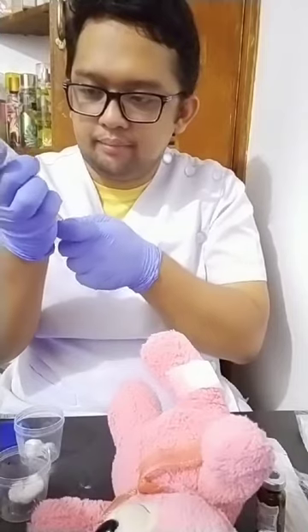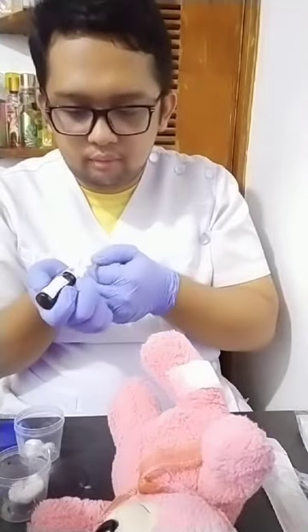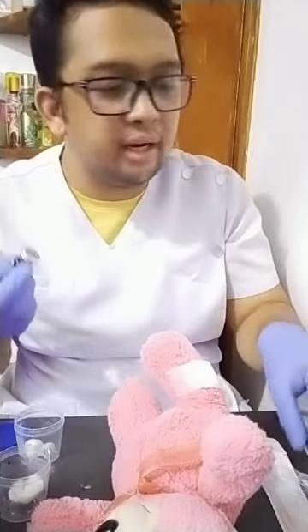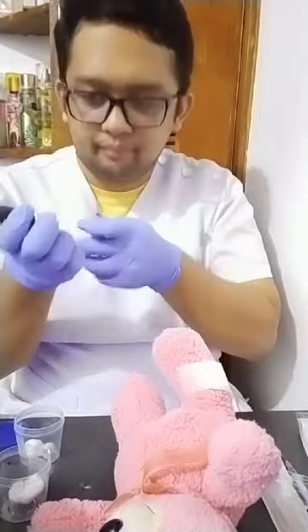Next, for the subcutaneous vaccine, we have the MMR. In preparing, also likewise, sterile water, aspirate, then mix it well with the vaccine, assuming that it is powdered form. But there are MMR that is not powdered form. So re-aspirate it.